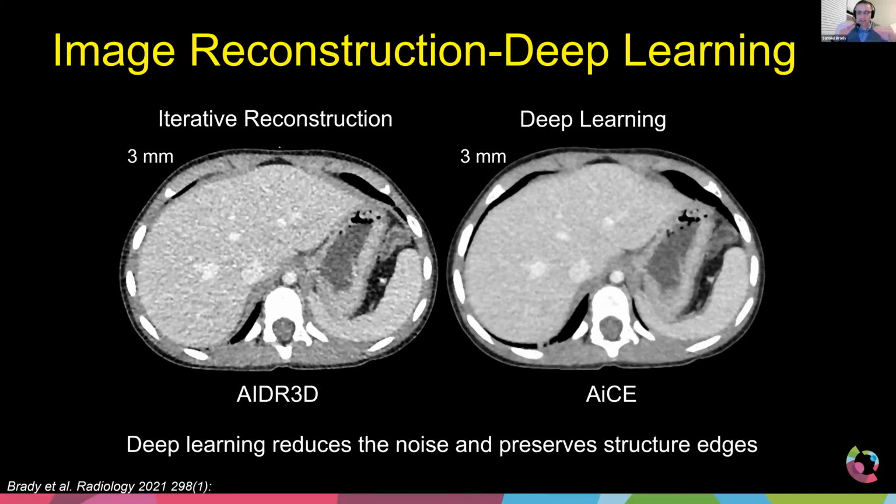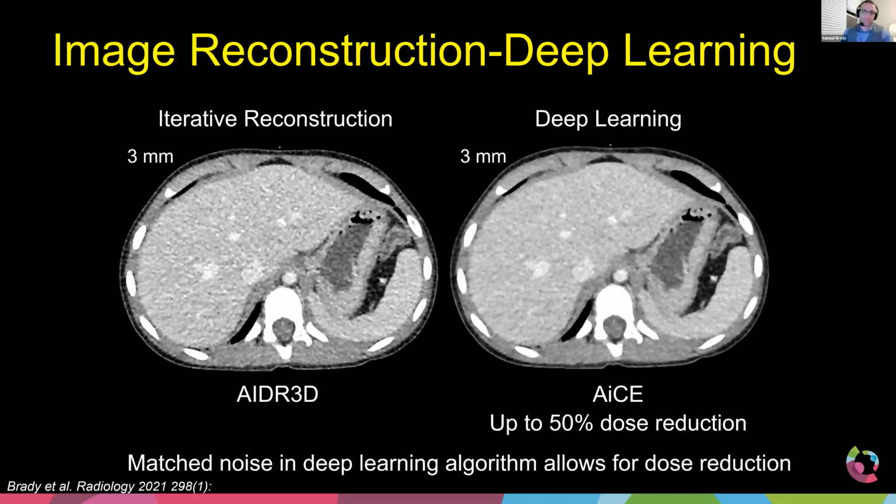I think we're at a point in most of our institutions where we've brought the dose decently low. We've seen your guys' dose, your diagnostic reference levels, as a country, your values are actually middle to low, which means you guys are probably doing really good. And so turning this on improves the image quality. So the images that may be a little extra noisy because you have reduced your dose, well, we're going to get rid of that noise for you and hopefully make it a little better for you.